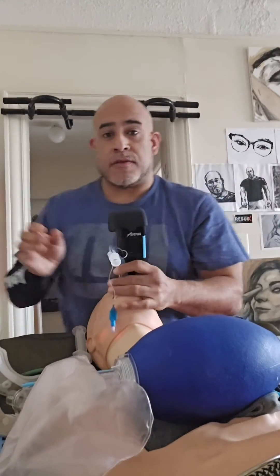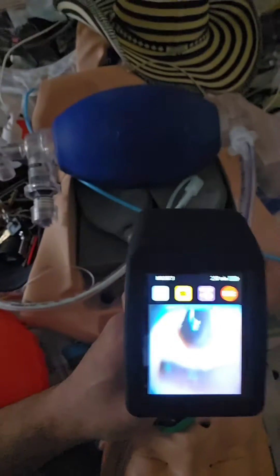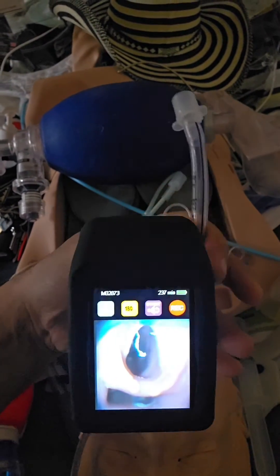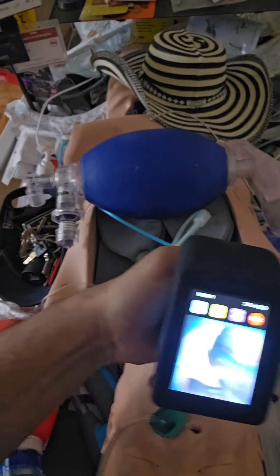Same technique: see the cords and push through. And for those who don't believe this trustful face of age and white whiskers — this is what I see, and I push the tube in.